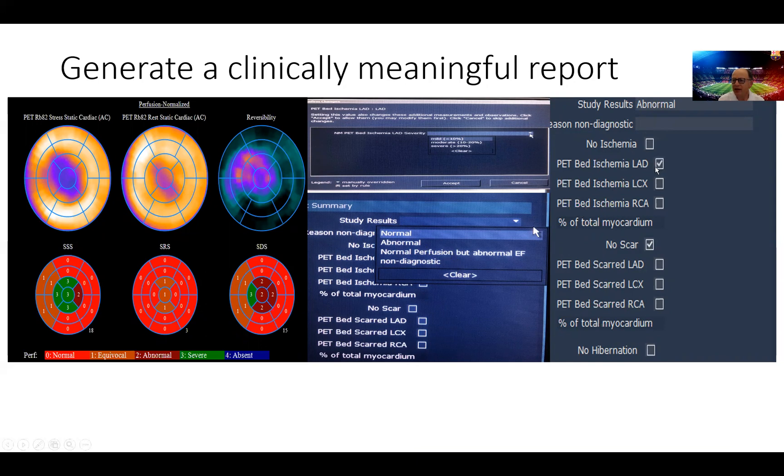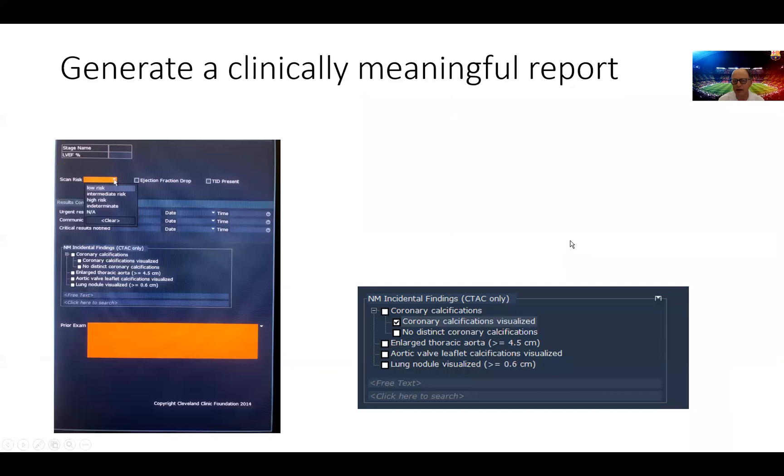The area, the bed of ischemia is the LAD. We can have a choice here between mild, moderate and severe depending on the size of the defect and where it was. We interpret the study as no scar but again because we did not have FDG to ascertain the presence of scar. But we interpreted ischemia in the distribution of the left anterior descending artery.